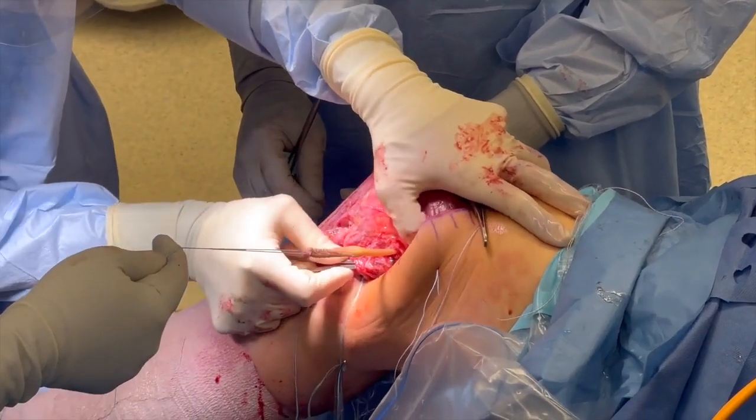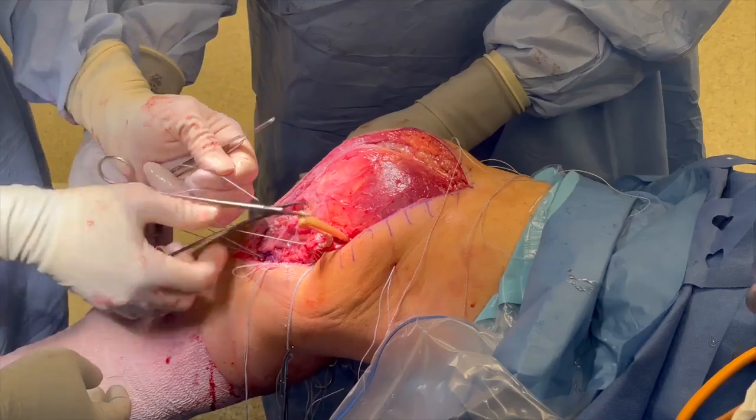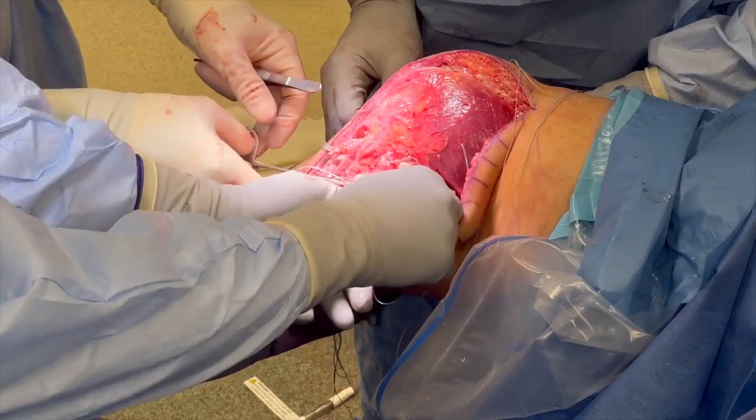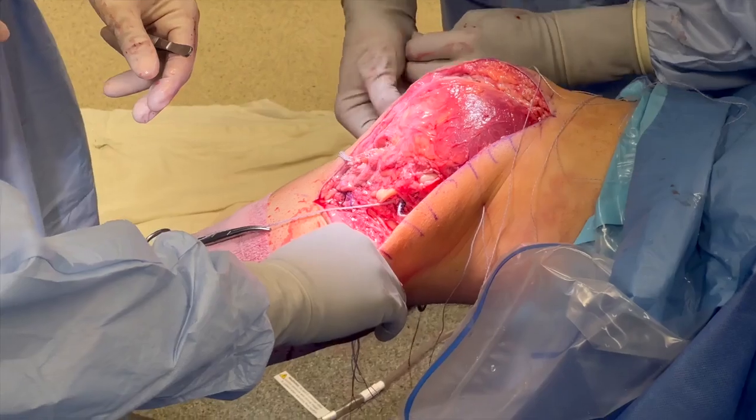Soft tissue channels are made from the femoral MCL and POL tunnels to their tibial tunnels. For the MCL, a channel is made under the superficial sartorius fascia between the two reconstruction tunnels. For the POL, a channel is created under the posterior medial capsule layer. Both grafts are passed through these channels and passed in their respective tibial tunnels.